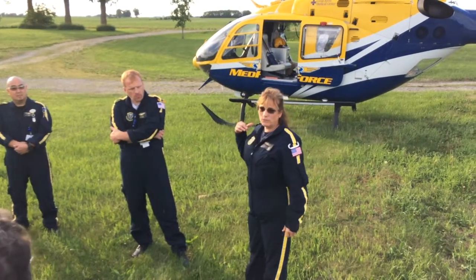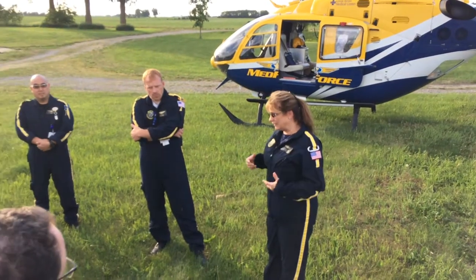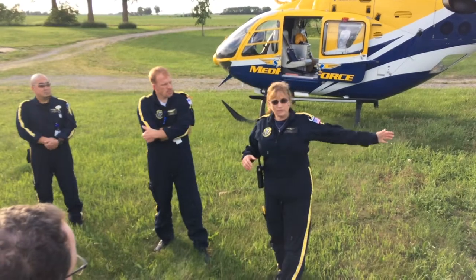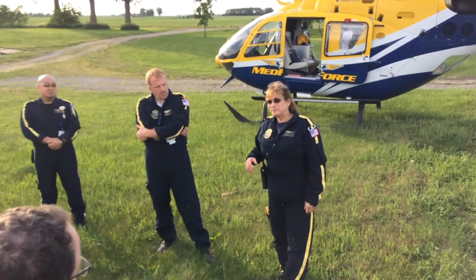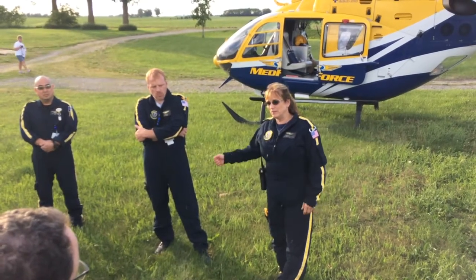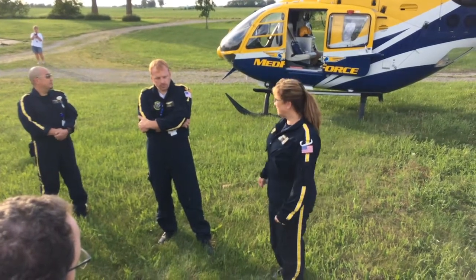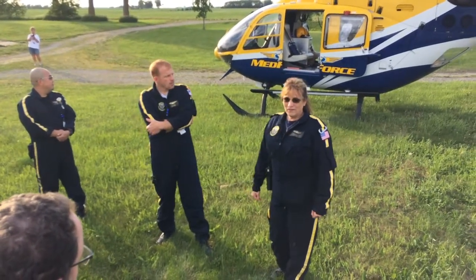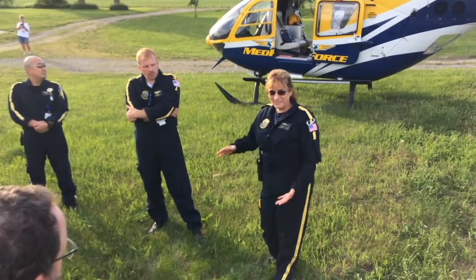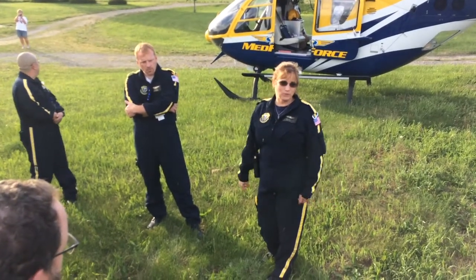We would also prepare our equipment. We have a stretcher that loads and unloads — we don't always unload it depending on what type of surface we're landing on. If it's a roadway, unloading a stretcher is fairly simple on a smooth road. But if we're going to be bouncing across a field, that might not be the easiest thing. Depending on how big the patient is and how much stability we need, we may need three or four people to help load them.